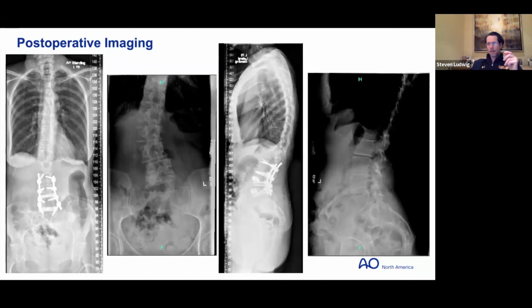I think the one thing that you have to be concerned about is migration of everything, because gravity sucks and everything sort of goes down to the ground. So you have to be careful with your retractor, that you have it nicely anchored, with a good intradiscal stability shim, so that you can do your intradiscal work effectively. I think that's important as well. But once again, you have to master this technique in a lateral, gold standard technique before you move into that prone, more expert technique, just because it throws you off a little bit.